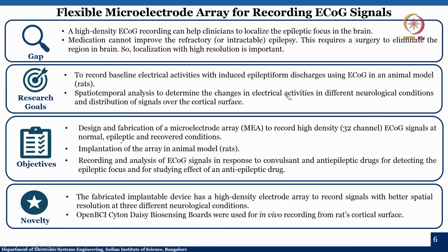When we say EEG, I mean ECoG, which is electrocorticography signals. Finally, from the novelty perspective, the fabricated implanted device should have high density electrodes. But in reality, if you want to go through the gaps and find the solution, the fabricated device should have high density electrodes to record signals with better resolution in 3 different neurological conditions. OpenBCI Cyton tool was used for in vivo recording.